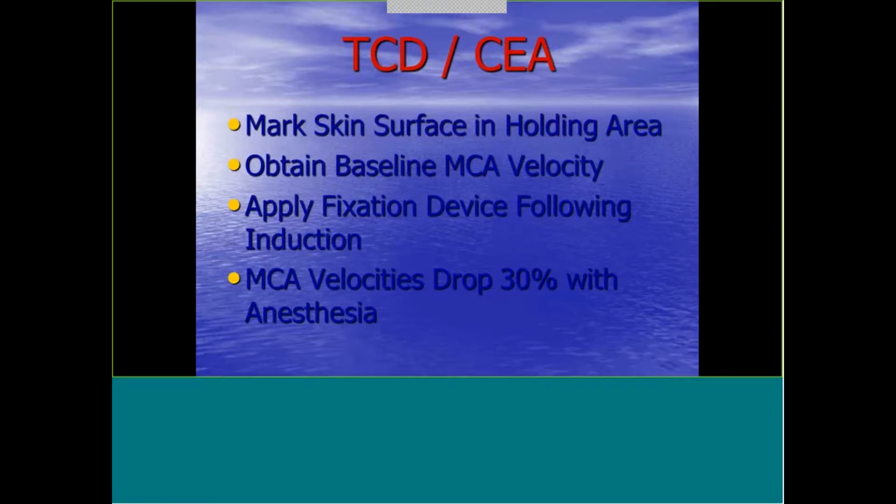You're going to want to see the patient in the holding area. So, you're going to have to be there early, 6:30 before they leave to go into the OR. You're going to want to do a transcranial. Check and see, number one, do they have windows? Am I going to waste my time in the operating room doing an evaluation? No. Do this in the holding area. Do a complete study, because remember, you get paid for not only a complete study, but you get paid for being in the OR as well.